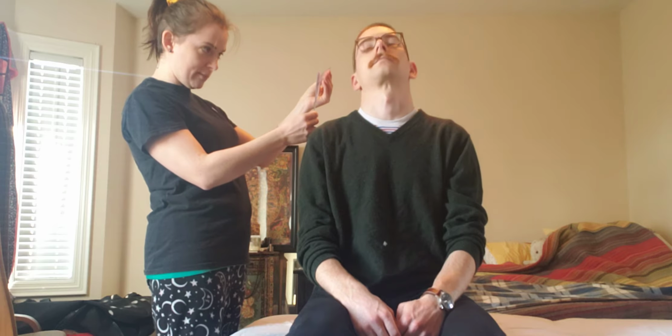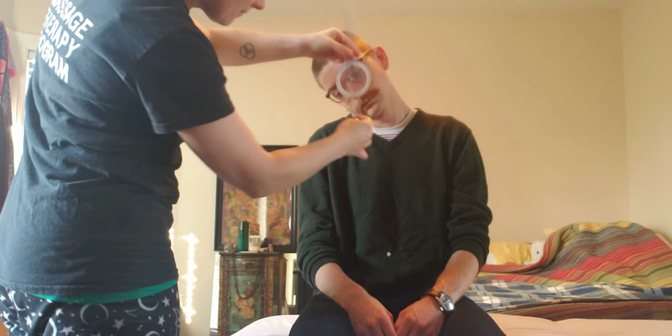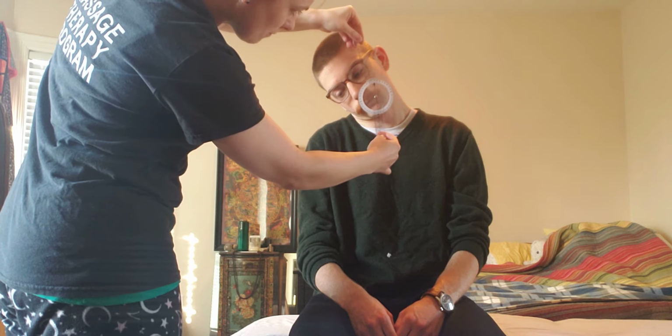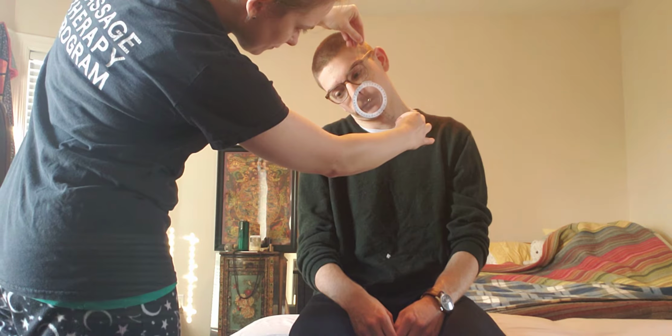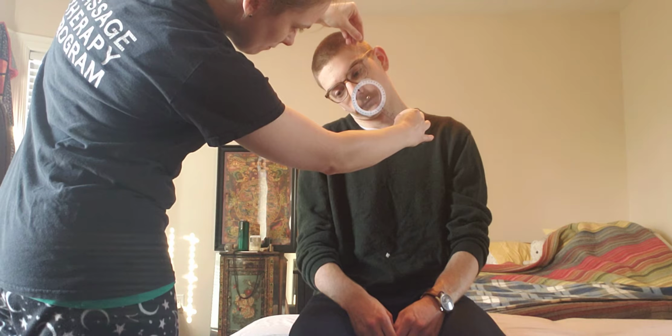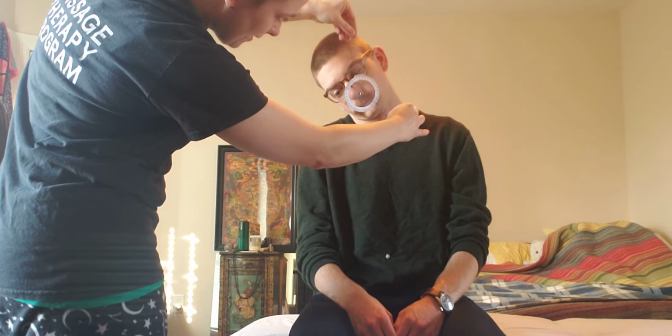And Cameron's a little bit limited. He's at 58 degrees. I'm going to get Cameron now to drop his ear to his shoulder. And he's at 45 degrees here, so that's normal, but it's still a little bit limited.